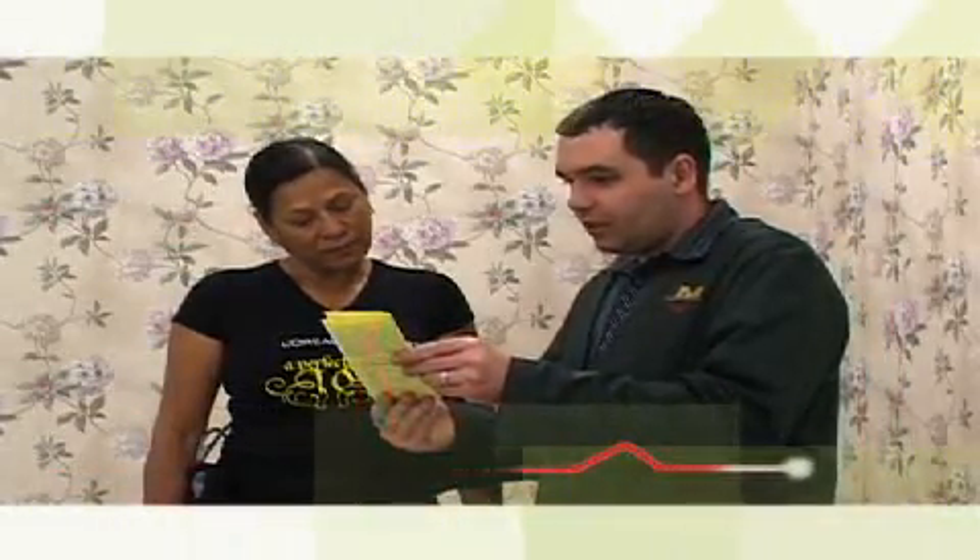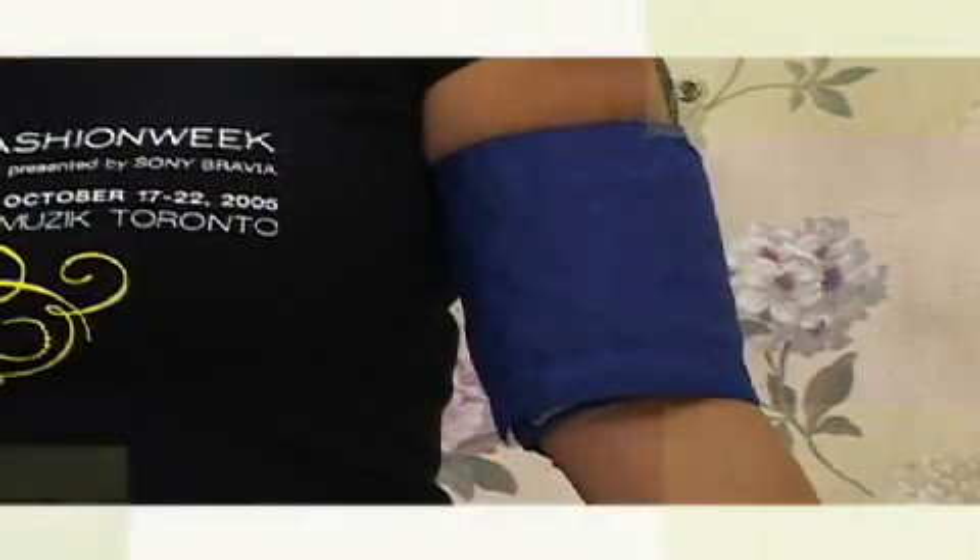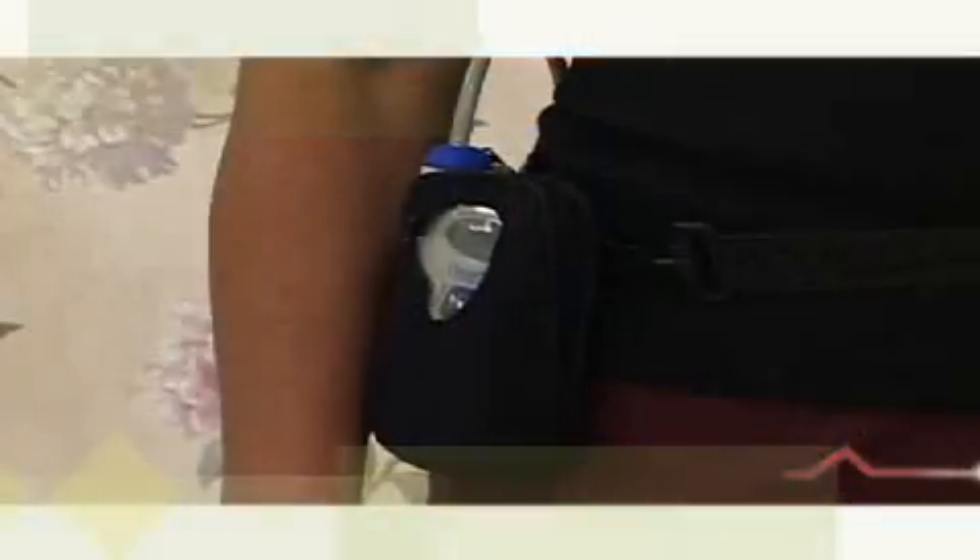The cuff will automatically expand and squeeze your arm slightly, similar to having your blood pressure taken at your doctor's office, every half hour during the daytime and every hour between 11 p.m. and 6 a.m. Perform your usual activities while wearing the monitor, and write down the exact times in the booklet when you perform specific activities.